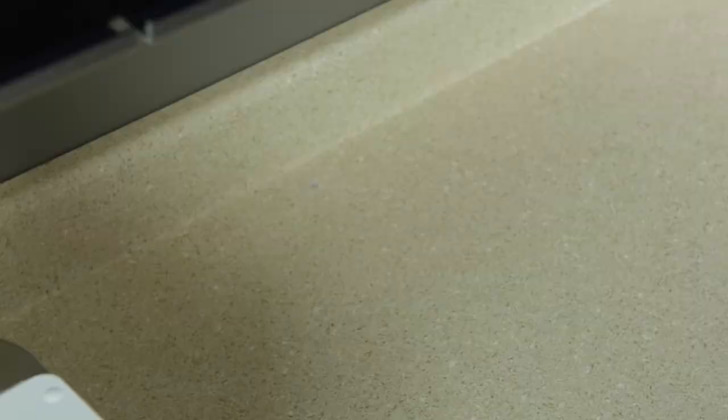The sound is simply a sign that a degas cycle may be required. For more information on your UC150, consult your instructions for use or visit Coolteen.com.